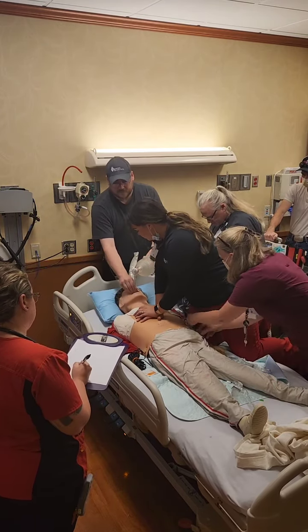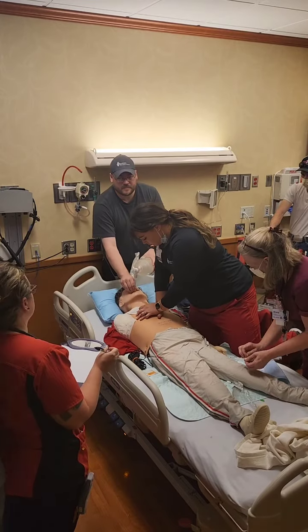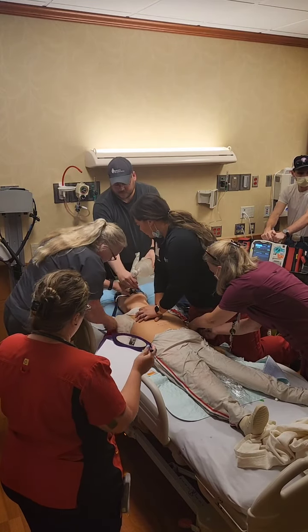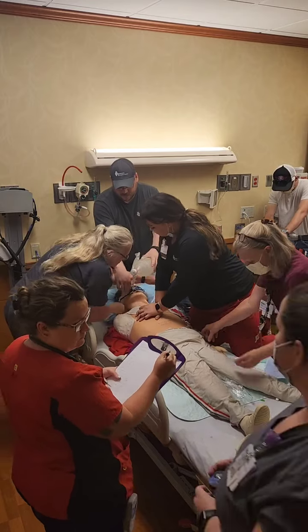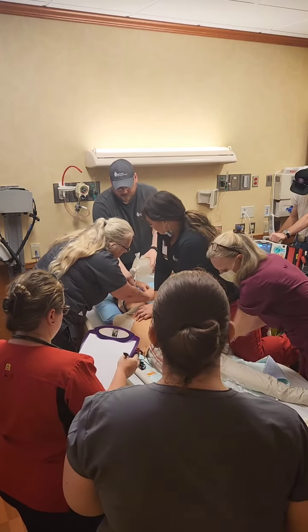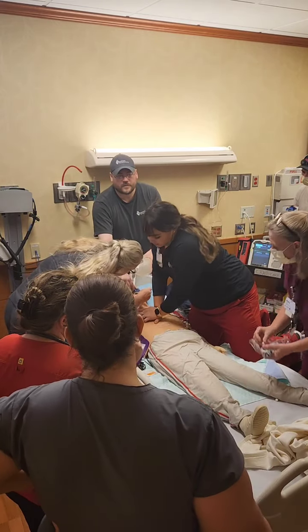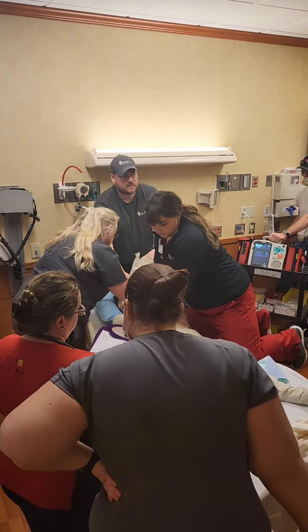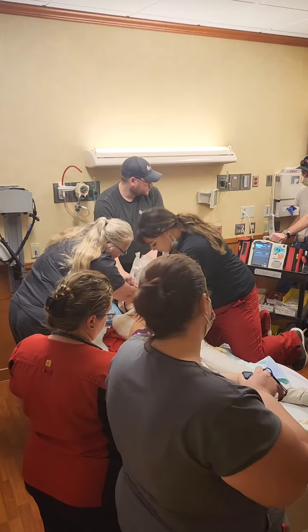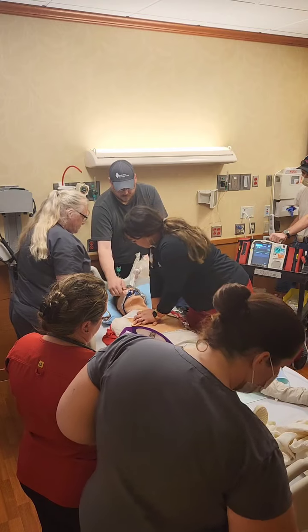Flush. Anybody taking time out? Yeah, we got a time. So we need a chest x-ray for line placement. Is the tube in? Probably want to get that after the Epi. We gave Epi what time? 13:21 by my watch, I could be wrong. I wouldn't really know what he has on the monitor right now because we're doing chest compressions.